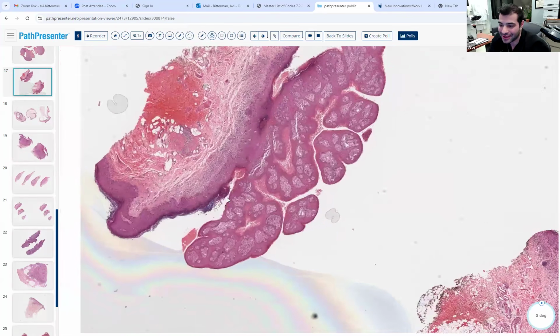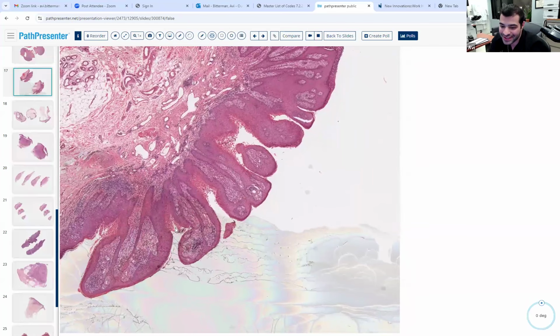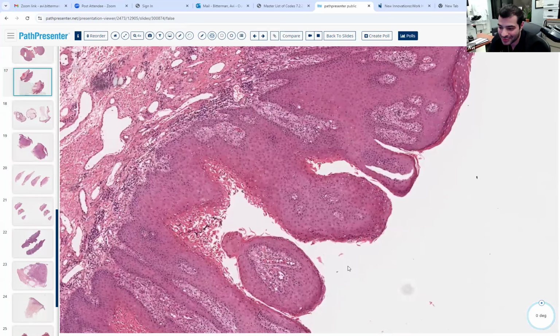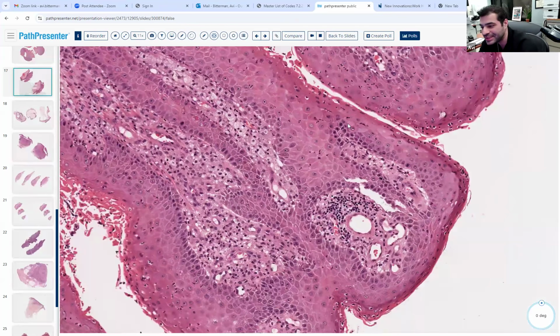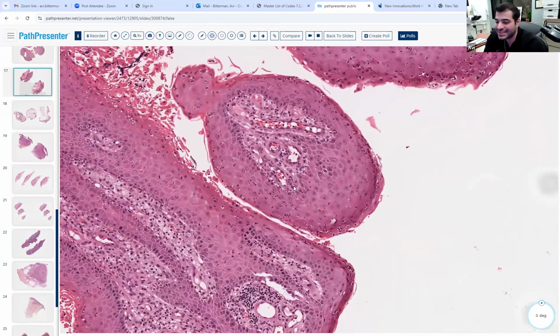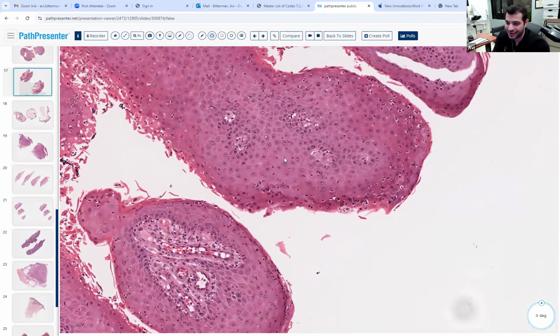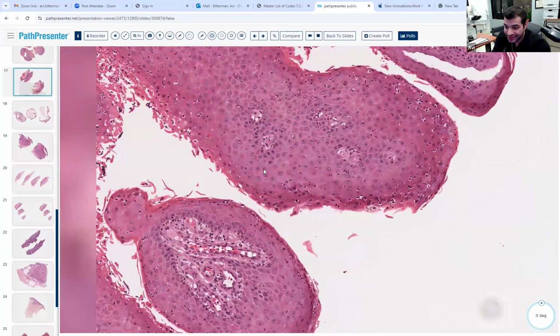So, verruciform xanthoma has a papillomatous architecture. You have these V-shaped eosinophilic areas. Some describe them as a wart on fire. The key is, as you honed in on, those foamy cells, and it's not subtle. Once you see it, you're not going to forget it. The neutrophils are a very good clue to verruciform xanthoma; I personally found these are often loaded with neutrophils.